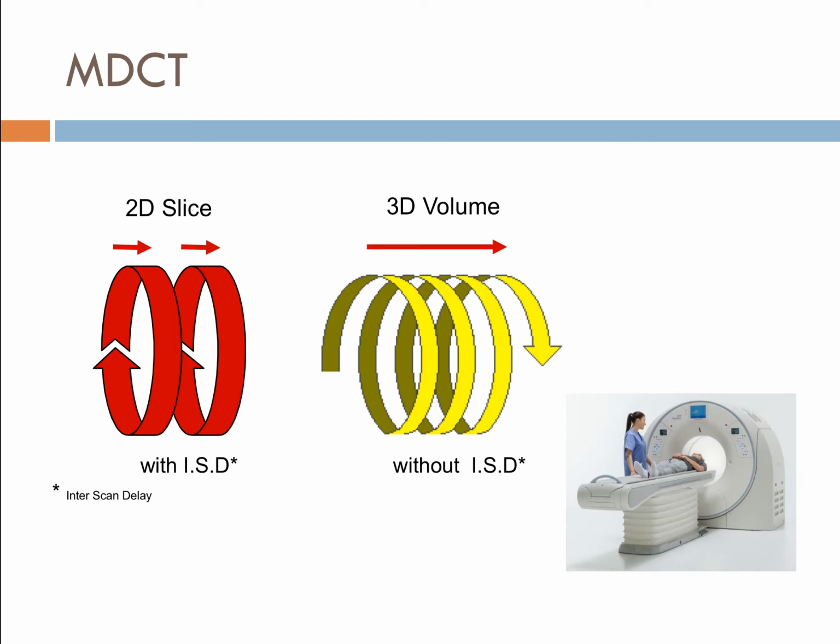And that's the advantage of this, the fact that we can introduce that contrast media that I was talking about in the previous lecture and get that really crisply on the screen. We can do multi-phases, so we can do the arterial phase of the contrast media, in the case of the liver, the portal venous, and then the venous phase. So we can actually be a lot more creative about what sorts of pathologies we're trying to detect, and be a lot more creative about the sequences that we use to highlight any pathologies.